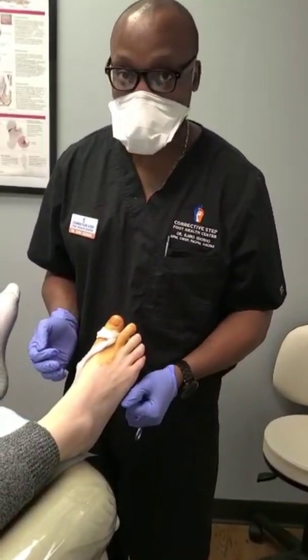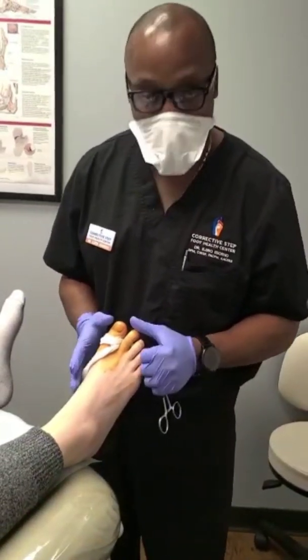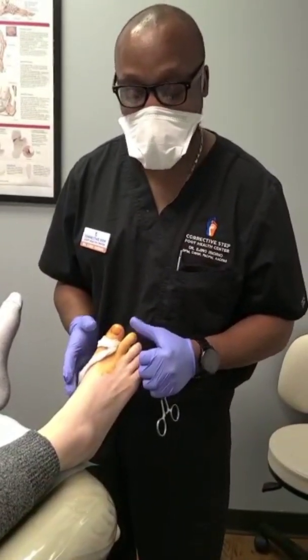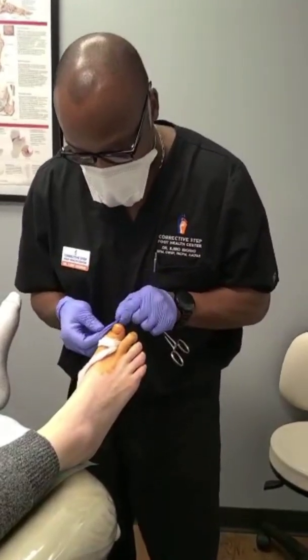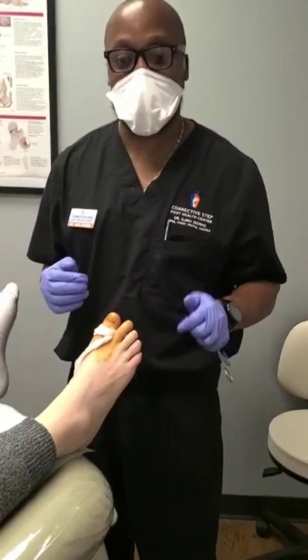They were just born this way. Unfortunately, when they wear shoes or do certain types of activity, when their feet swell up, it pushes on that soft tissue to nail and causes an impingement. So instead of just taking the part that's pinched, I'm actually going to take a little bit more just to avoid that corner.